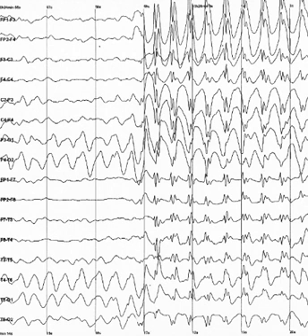The meninges, cerebrospinal fluid and skull smear the EEG signal, obscuring its intracranial source. It is mathematically impossible to reconstruct a unique intracranial current source for a given EEG signal, as some currents produce potentials that cancel each other out. This is referred to as the inverse problem. However, much work has been done to produce remarkably good estimates of, at least, a localized electric dipole that represents the recorded currents.